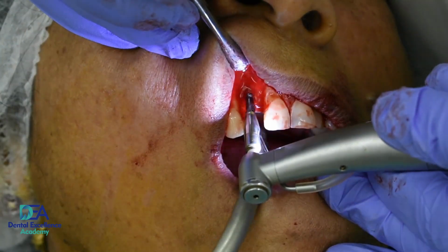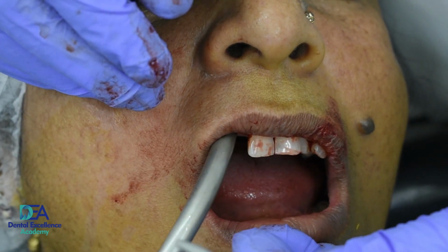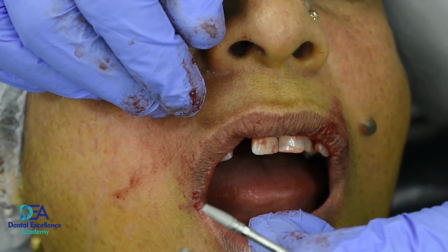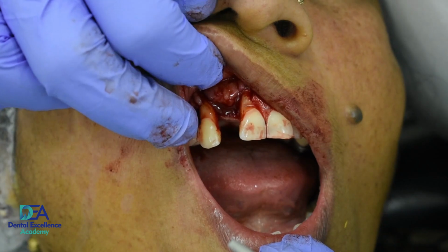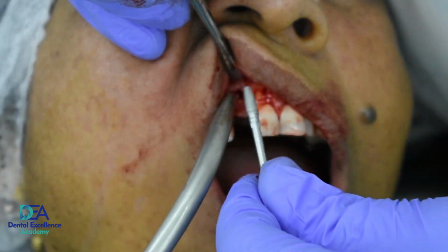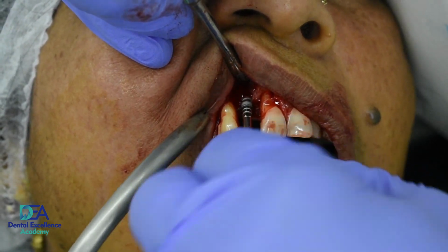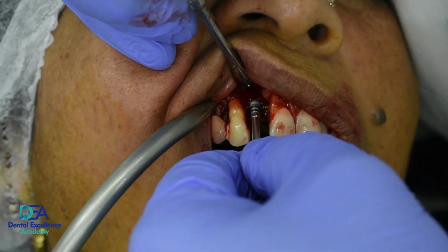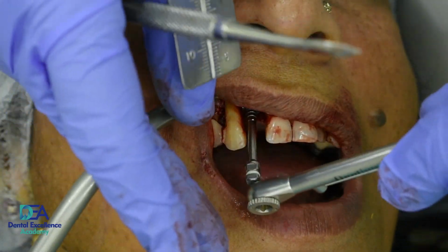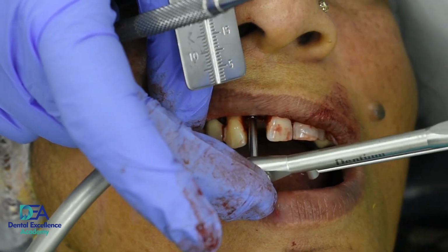Now I'm placing the implant. You can see this is the iFix implant. It is a 4 by 10 iFix implant. So I am going. You can see it is almost parallel to both the teeth. So we are going to extract the canine. So we'll be correcting the direction for the canine.